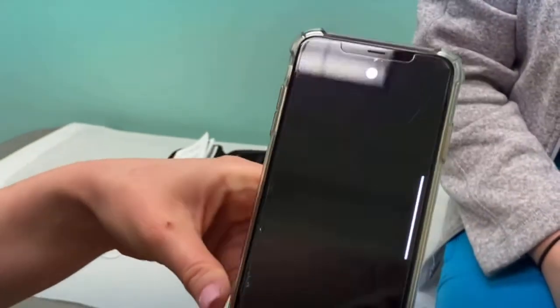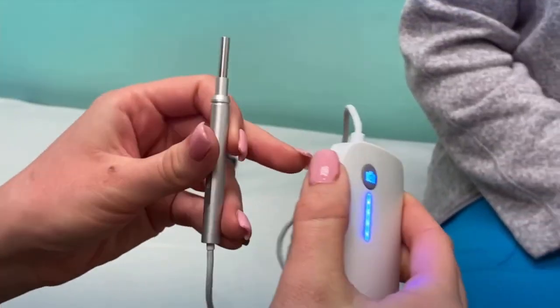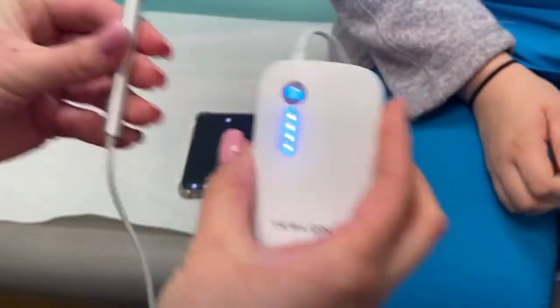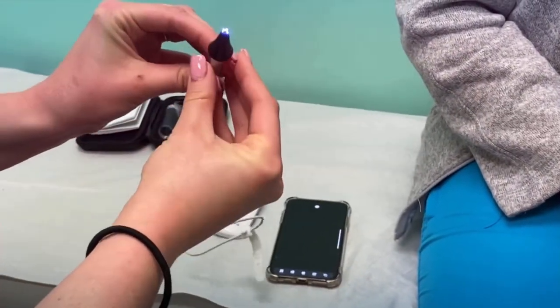Now that we have it all connected to the device, we're going to want to go ahead and turn on the little lamp. Now that we have the lamp on, you can see — we're going to put a little endoscope cover on there onto the device just like so.